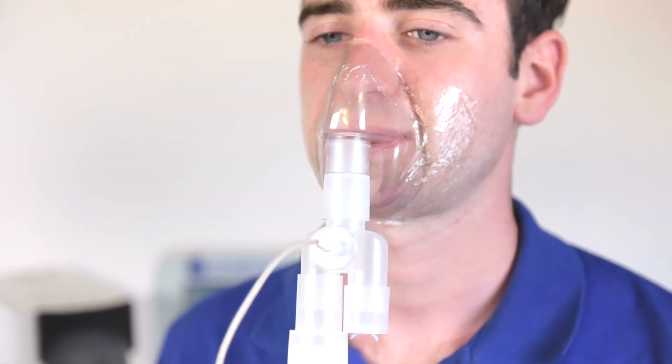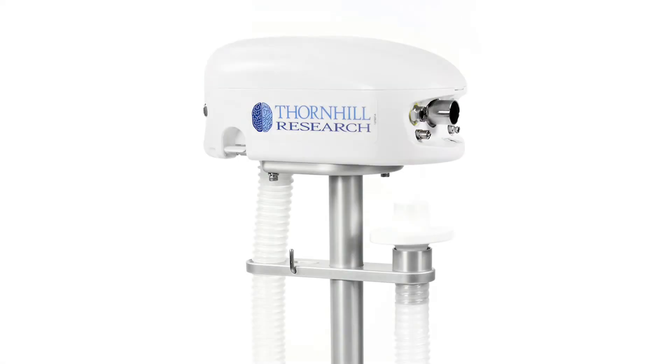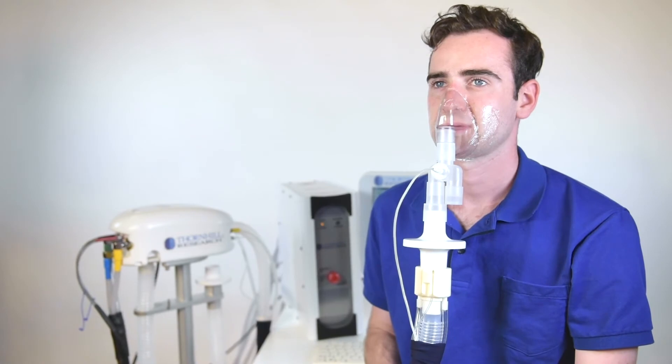The subject is connected to the system with a face mask. As a subject breathes, room air is inspired through an intake located under the MRI unit and through the O2 reservoir. When the device is not in operation or actively running a study sequence, the subject will continue to voluntarily breathe room air.